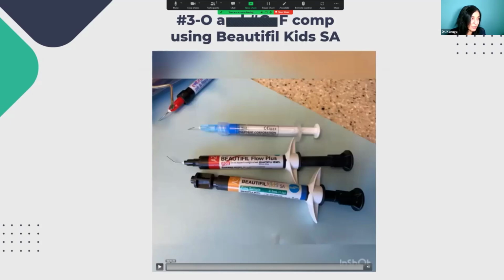Okay, so the good thing here is, all I wanted to point out is that, although number 3 and number C are teeth that are not next to each other, it's possible to accomplish treatment very fast and effectively under Isolite isolation. So it's a combination of the right isolation technique and the right dental materials that makes this very fast and efficient. Sorry, it doesn't let me fast forward the video. So I'll move on to the next slide with respect to time.